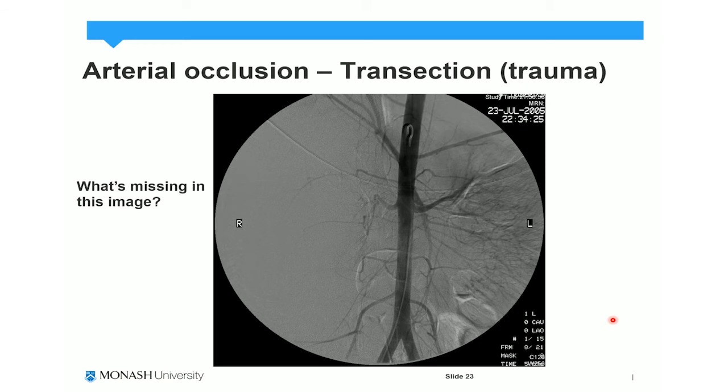This is a trauma case where a patient had a transected right renal artery. We can see here a lot of devascularization, or we're not seeing a kidney show up on this area. We can't see this on angio because we're only seeing where the contrast is being injected. It has a large hematoma around it. So the kidney that we would expect to fill should be in this region. And we're not even seeing any bowel, and the hepatic artery is actually being pushed out of the way and the bowel being pushed to the patient's left-hand side due to this hematoma.